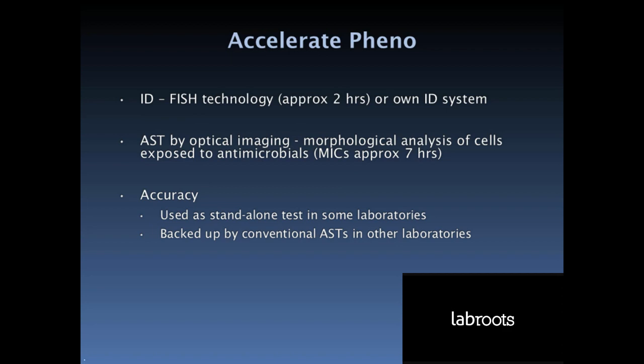This is a neat concept, and the Pheno is now in a number of clinical laboratories. Some laboratories use it as a reliable standalone test and report results without reservation. Other laboratories do not have the same comfort level and back up Pheno results with conventional tests, sometimes finding disagreement between the Pheno and the conventional results.